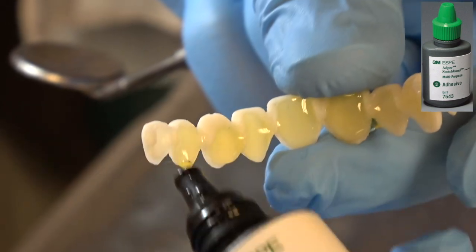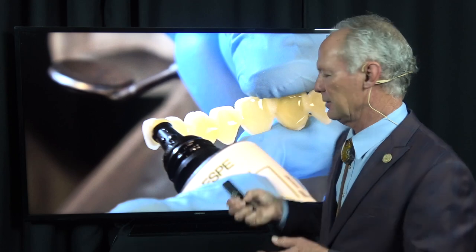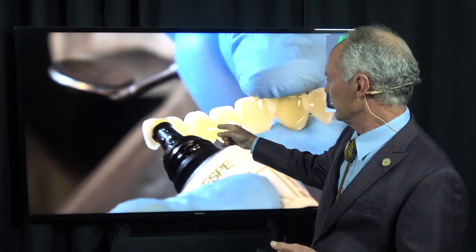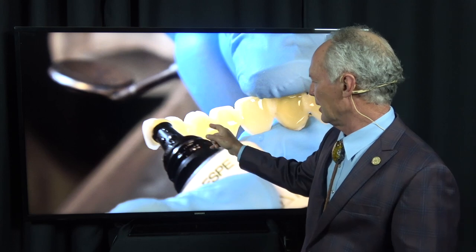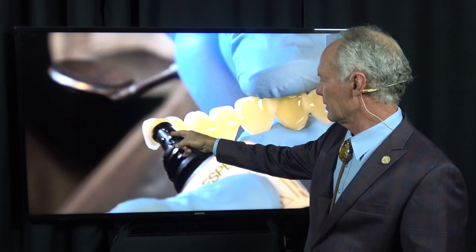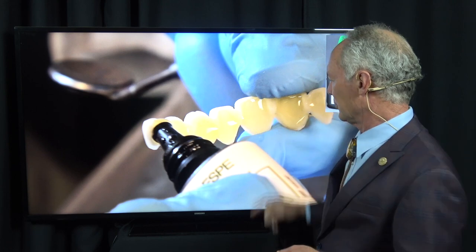Now, occasionally, the bicuspids, if you have this many teeth prepared, will flare out like a starched shirt. If that occurs, cut the provisionals between the cuspids and the laterals and seat it in three parts. Cuspid through second bicuspid, and then lateral to lateral, and then cuspid through second bicuspid, if they flare out when they're on the teeth during the try-in.